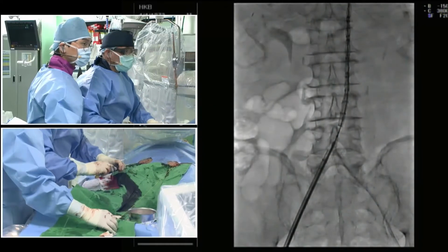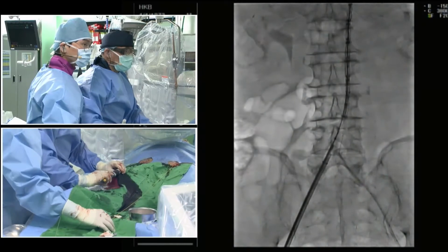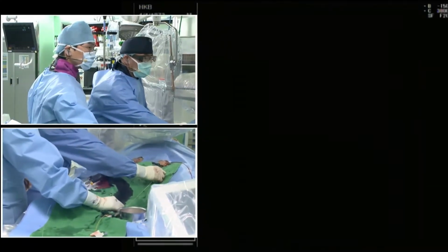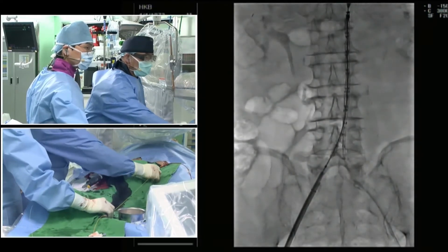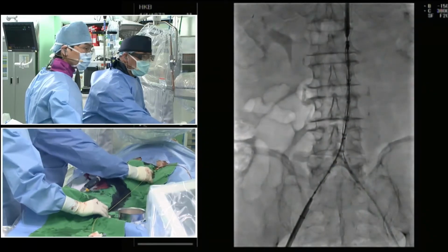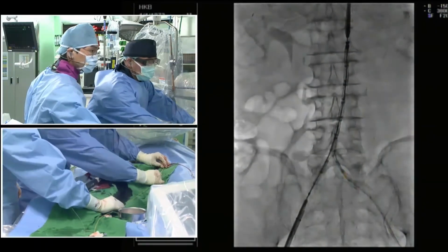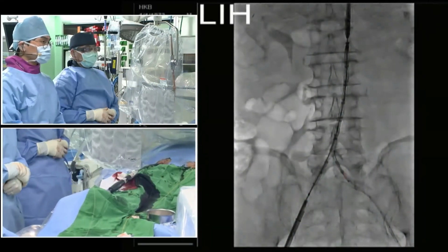Now here, because of neck angulation, you're going to lose length as you go. But you're building from the bottom up, so this is not a bad device to apply. You're seating at the bottom, the bifurcation, and then you can make your final positioning of your extension graft with plenty of overlap. It looks like this is a 100 millimeter length bifurcate, and then you have a 100 millimeter length extension aortic cuff. That should be plenty of length, even though you're going to lose quite a bit. So I think the device is just on the natural bifurcation.